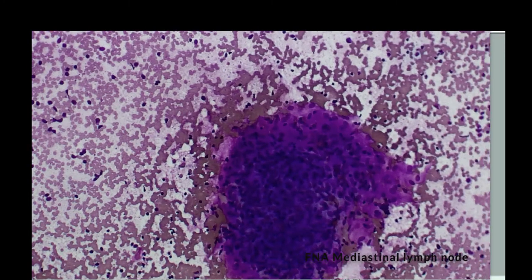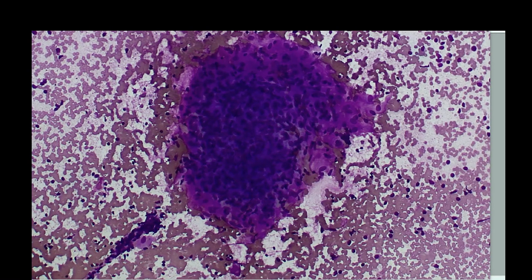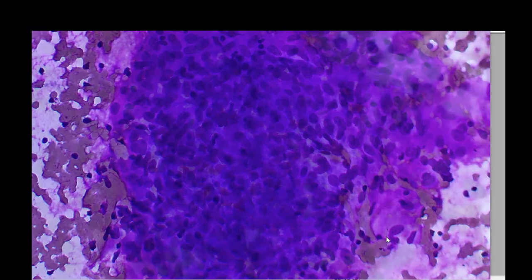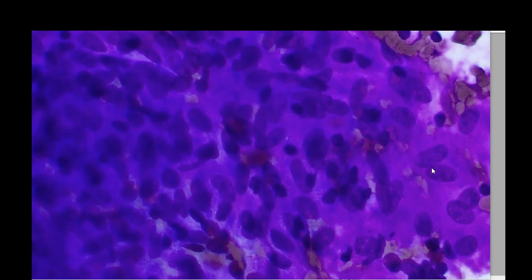This is an FNA of that, just showing the whole cells, and you can see we have a mass of epithelioid histiocytes here. They're forming like a cohesive mass, a bit like epithelial cells, but they're not truly making glands or anything. And the characteristic thing of these is that they have elongate, sometimes footprint or thong sole-shaped nuclei. You can see a few of them in here nicely. They've got that appearance of like a footprint in the sand.